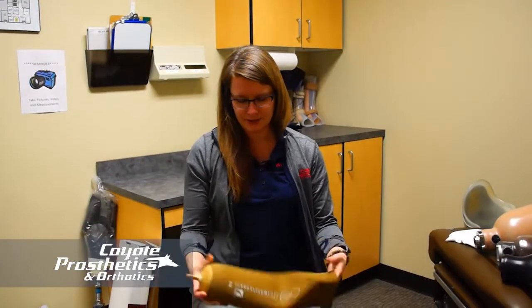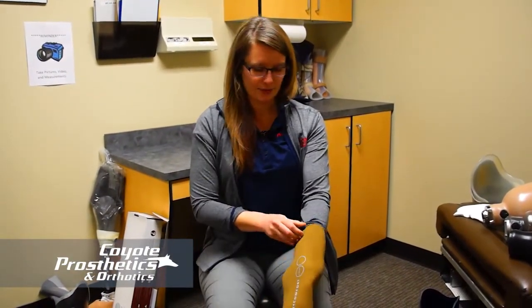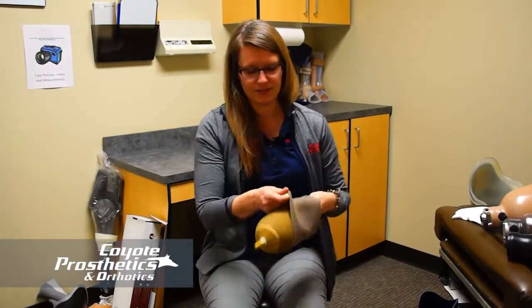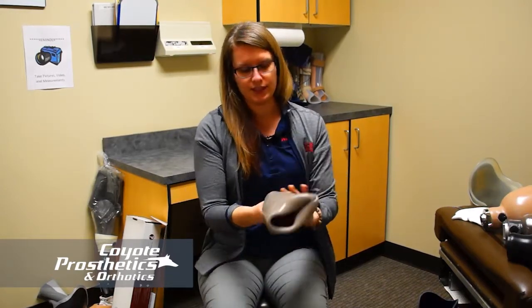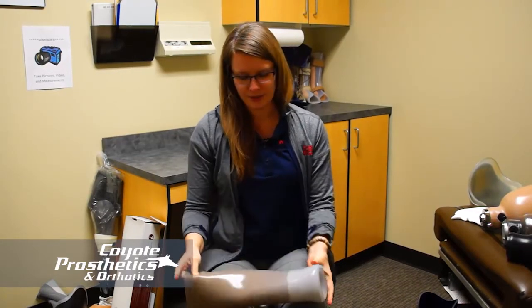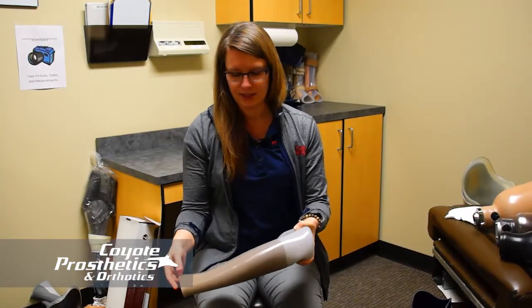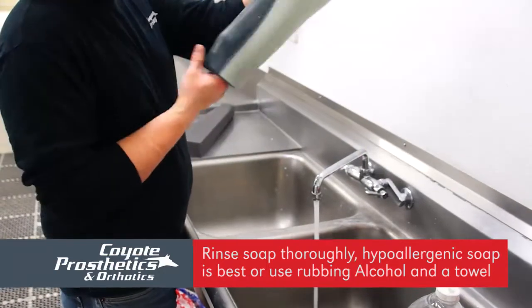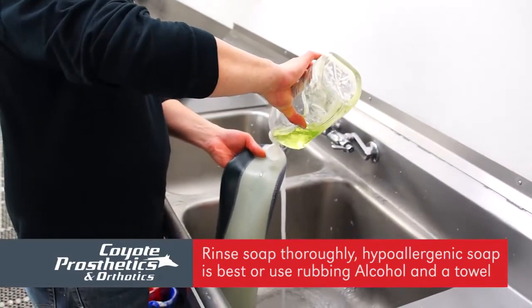So on the liner, how you're going to wash these, and you want to do this every day. This will help keep you from getting any kind of infections or anything. So you want to turn it inside out again. Some people do this in the shower, some people do this in the sink. Turn it inside out. You're going to want to wash it with a mild detergent, rinse it off really well. We don't want you to have any soap left on here to irritate your skin.